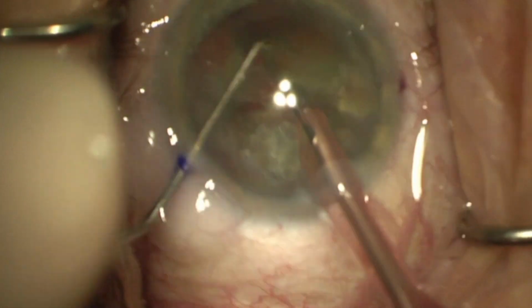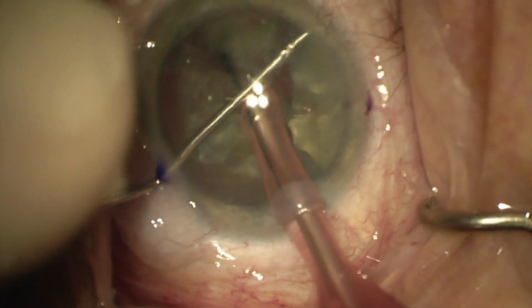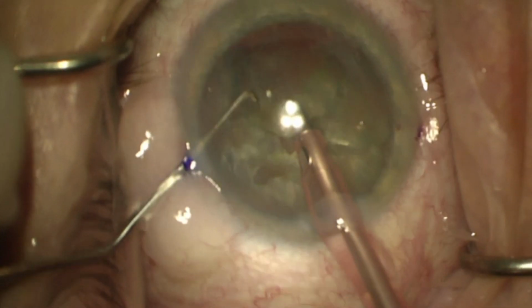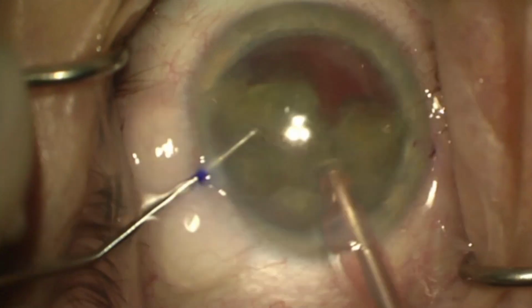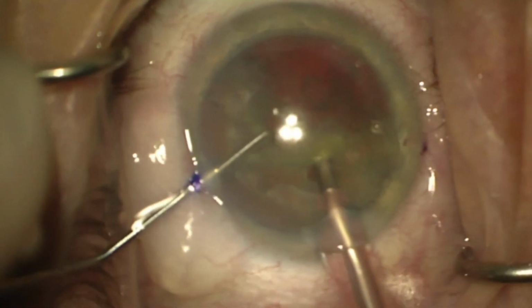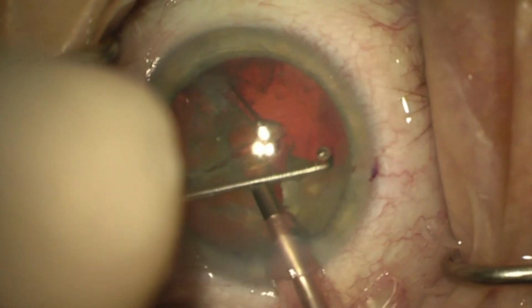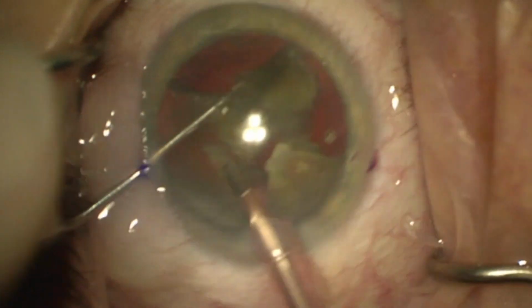It's best for vertical chop to leave the quadrants or the pieces of the nucleus in place to give lateral stability to the other pieces until you start evacuating them. And now once you have a split, it becomes easy. The first quadrant or first part of the nucleus to take out is usually the most difficult because there are still some lateral attachments, but after that it becomes easy.